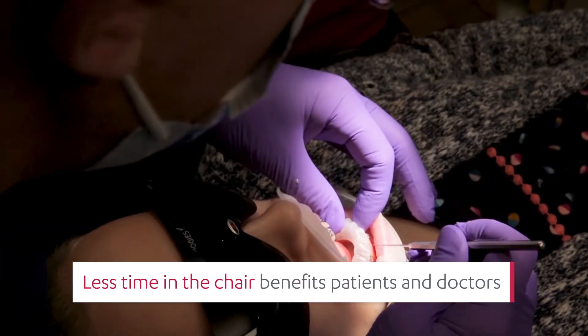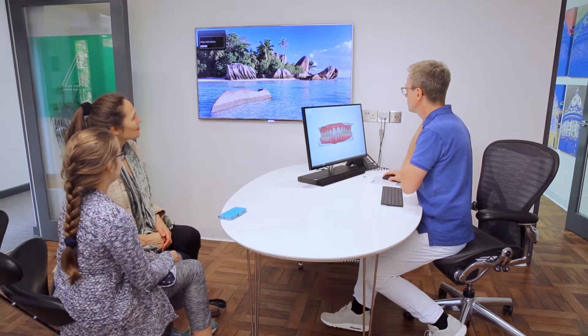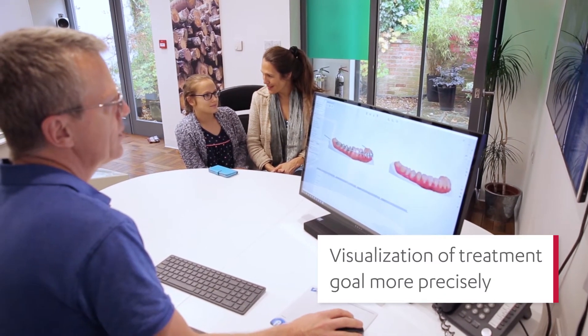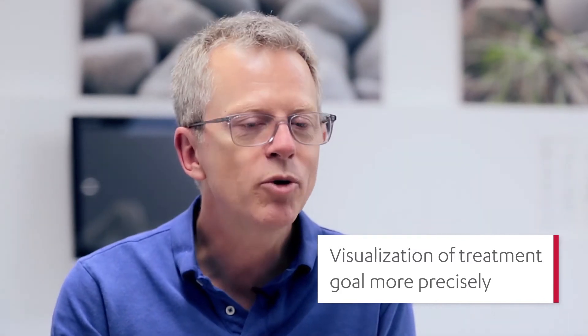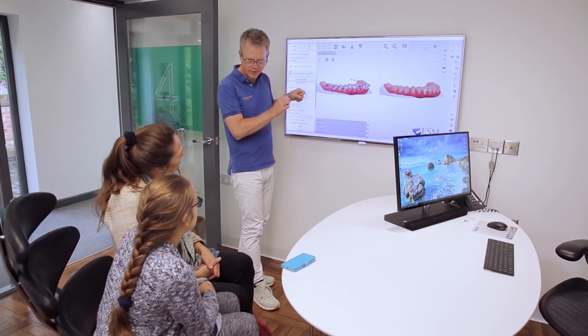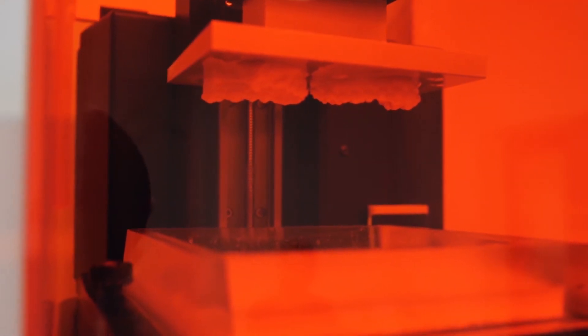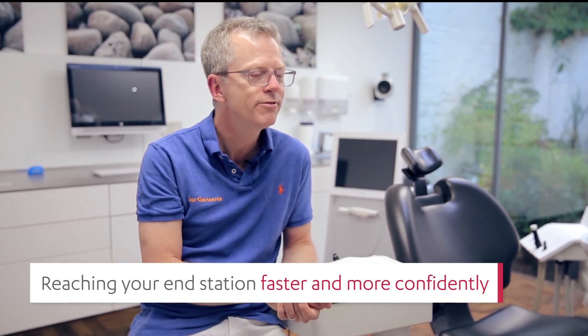The mechanics have not really changed, but the planning of the mechanics is possibly different now, and I feel I can visualise — to myself and also to my patients — a little bit more precisely what I'm setting up for in my journey. Whereas in the past we were sometimes doing things, watching what happened and then altering the journey as we went along, I think I am now able to more confidently get to my end station faster.